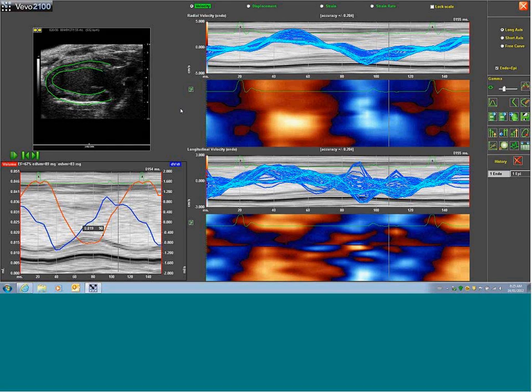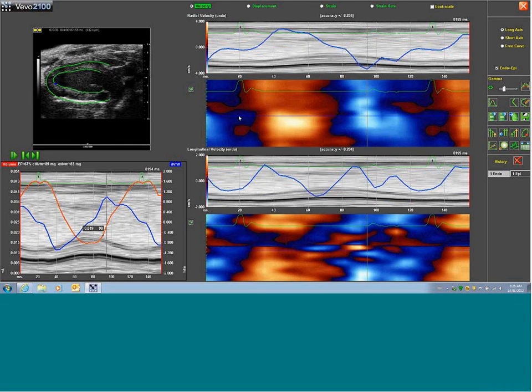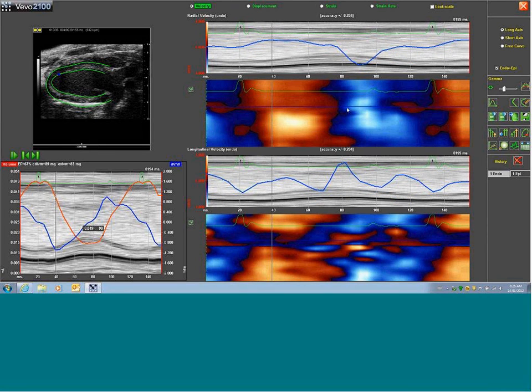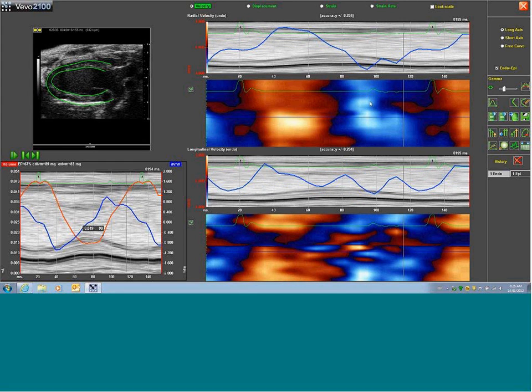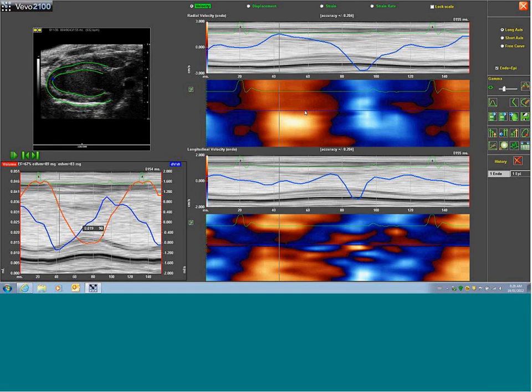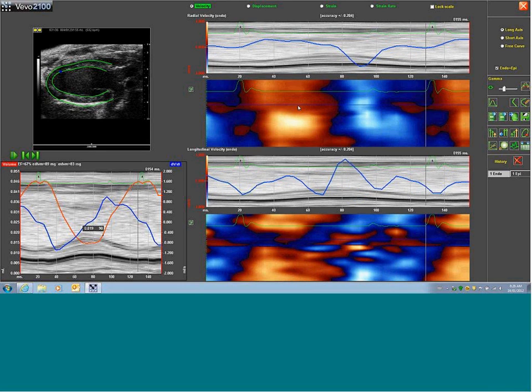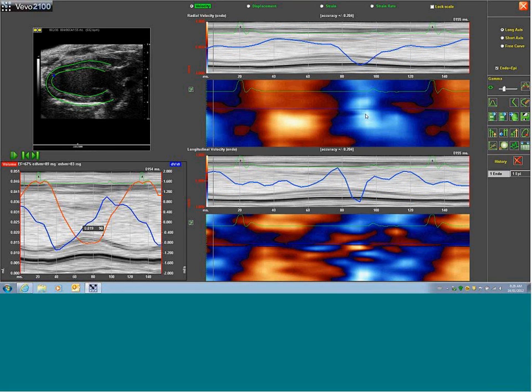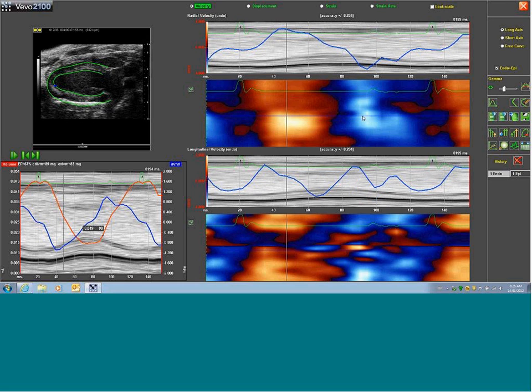I also draw your attention to the parametric maps. As mentioned before in the presentation, you're looking at systolic and diastolic changes. The red is indicating systolic. As I move my cursor over, and you can actually follow this through the Cine Loop, now I'm looking at diastolic changes. Another thing to note when looking at the parametric map is that it goes from a darker region of red to a brighter region of almost white. And the same thing goes with the diastolic, or the blue region.